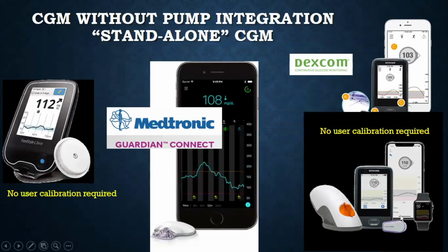So they insert the sensor, it reads their glucose and sends a signal either to a phone or a receiver, and does alert a patient, again, if there's a low, a high blood sugar or a fast rate of change in their blood sugar. So these are really helpful for patients who may not have awareness of their low blood sugars or who have significant changes and need to follow things very closely.